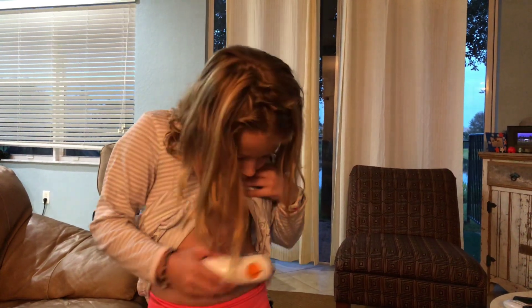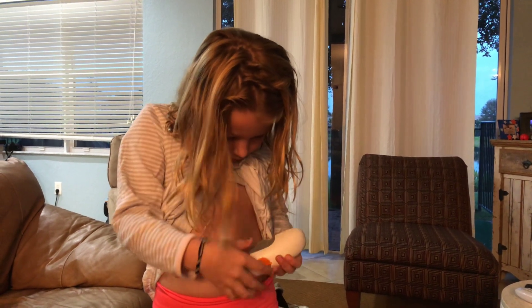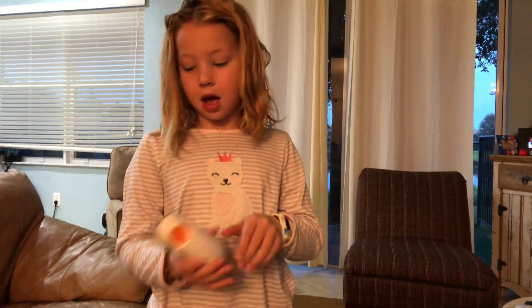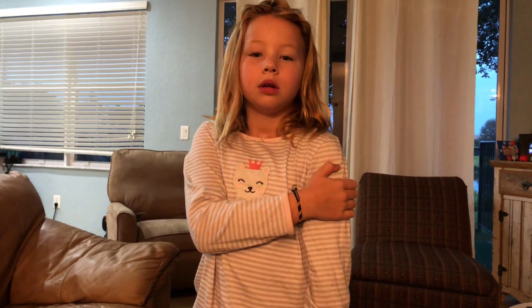Now I'm going to put it here so the needle is going this way. It goes on this side, which is weird, so I guess I'll put it on my arm instead.